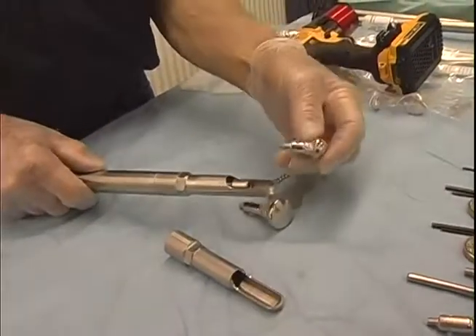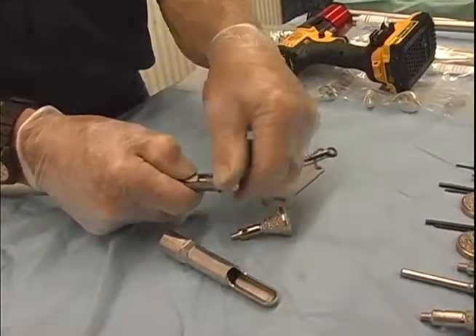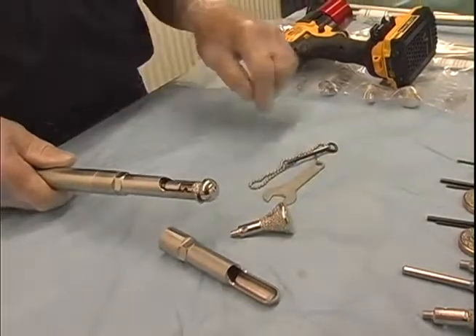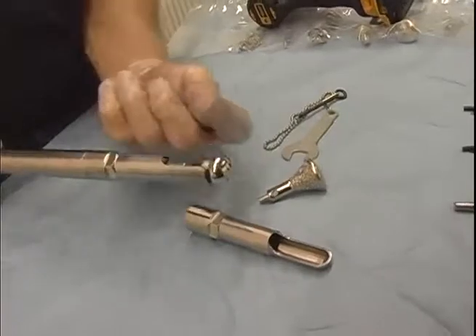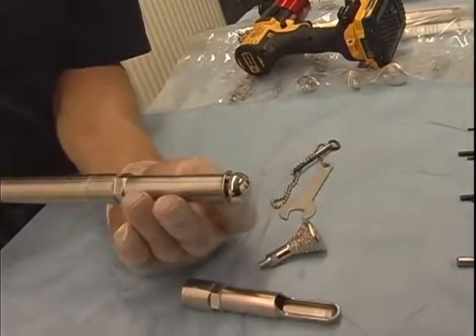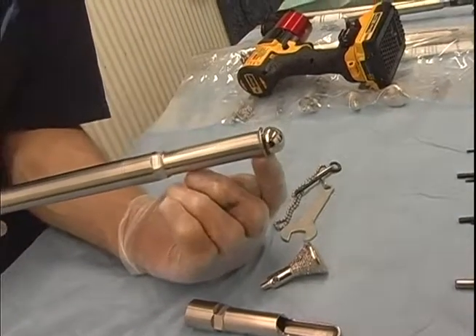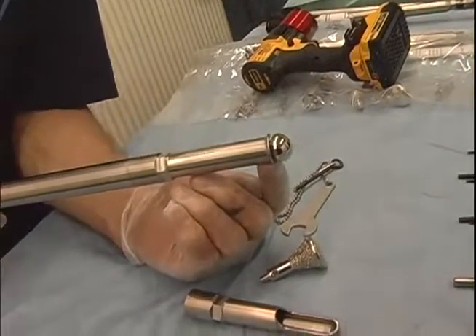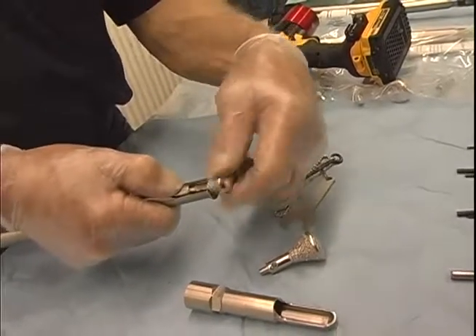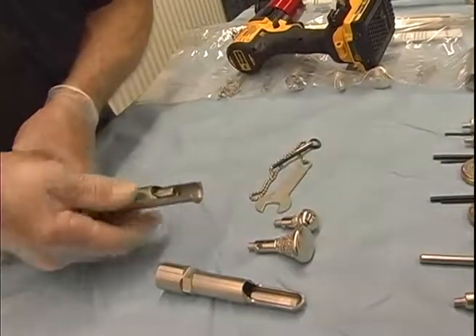The next burr that can go on here is for the last lower tooth, the lower 11 tooth. This also has a smooth edge, but in this case, this hooks onto the back edge of the last lower tooth, and the round edge pushes the gum back just enough so that you can burr the hook off the last lower 11 tooth. So in other words, this attachment can use both burrs, the upper 11 and the lower 11 burr.